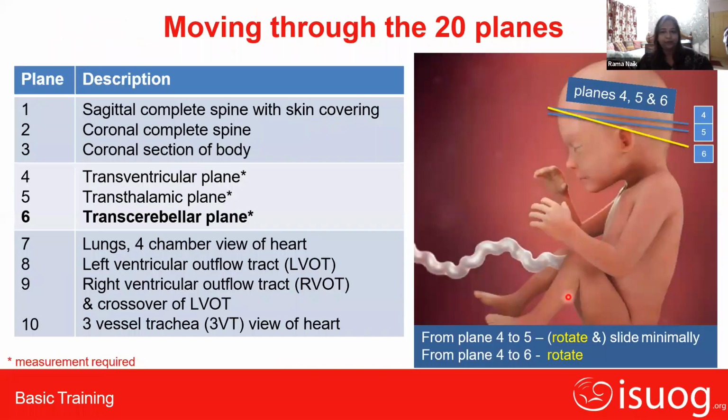Now I will explain the probe movement. Can you see me? Yes, we can see you.